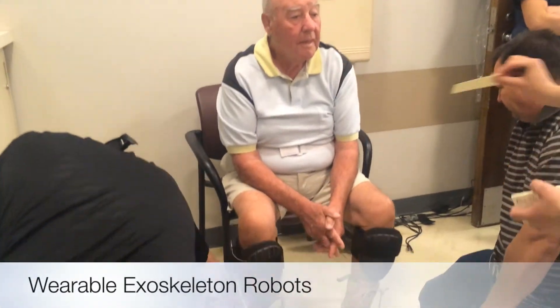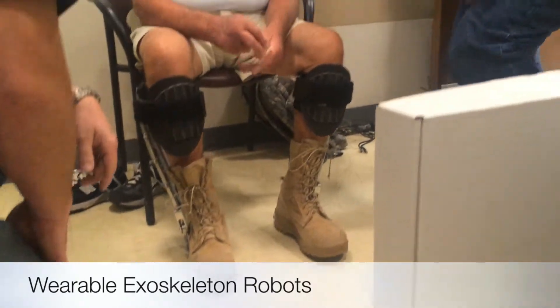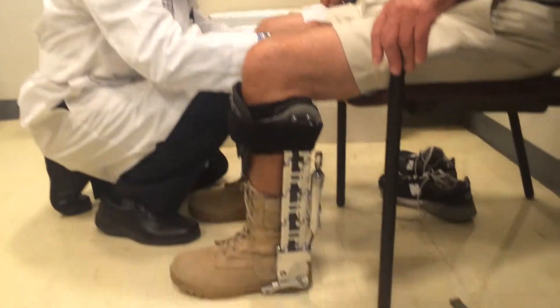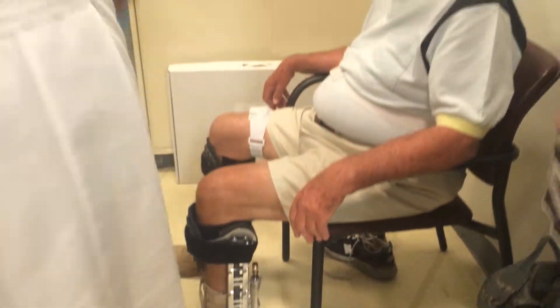This is some video clips that we took with a wearable robot brought to us by Spring Active. Spring Active is a company making a number of prosthetics — both limb replacements as well as wearable robots and these exoskeletons that you see here.